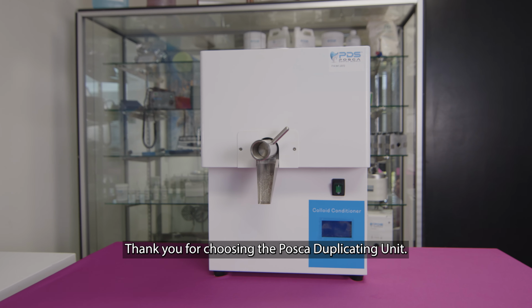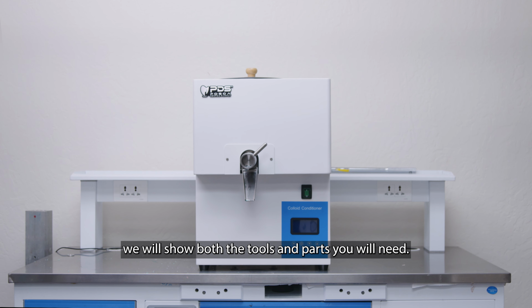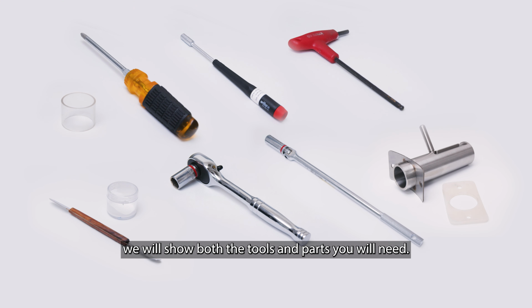Thank you for choosing the Posca duplicating unit. Today's video will be going over troubleshooting your unit along with in-office repairs. Before each section, we will show both the tools and parts you will need.